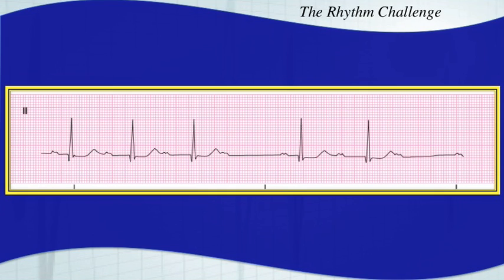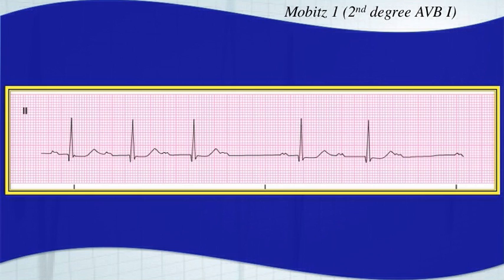Here's your next one. Take a good look at it. This rhythm is Mobitz I, or second degree type I, or Wenckebach. You see you have a PR interval that is prolonging — going, going, going — and then you have a P wave without a QRS complex. So going, going, going, gone. That is Mobitz I, or second degree type I.